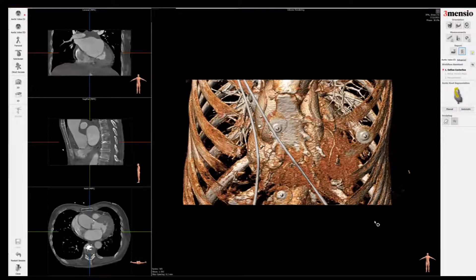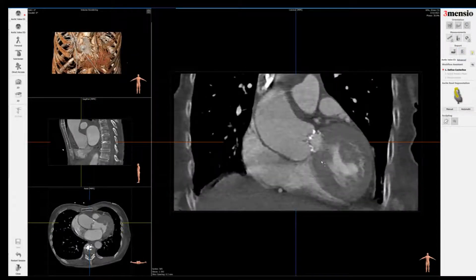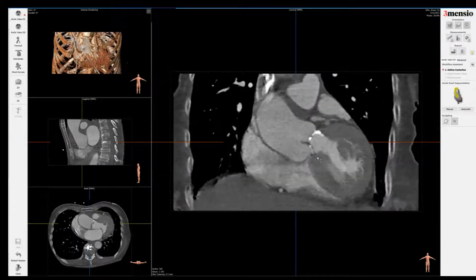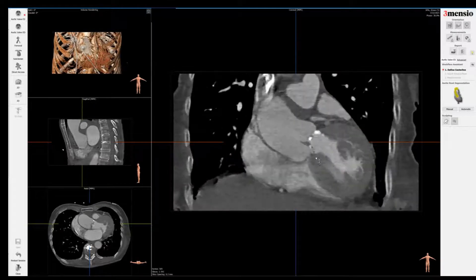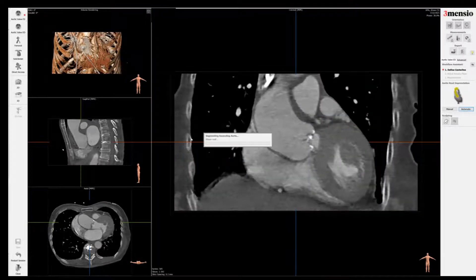Hello, this is part two of the bicuspid TAVR pre-mensio analysis. You can see that the screen is already set up. Let's look at the septal length — in bicuspid valves, there is typically very short or absent septal length, so we're going to skip that and go into the measurements of the aortic root.